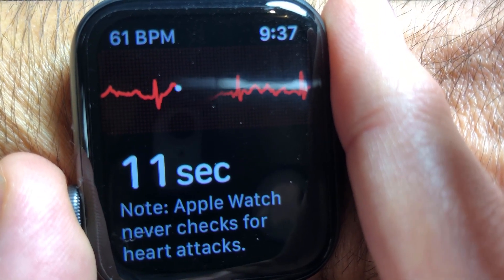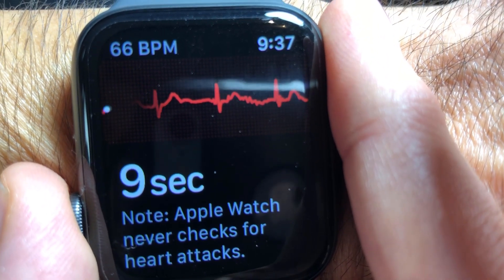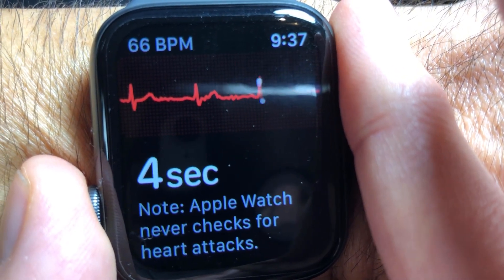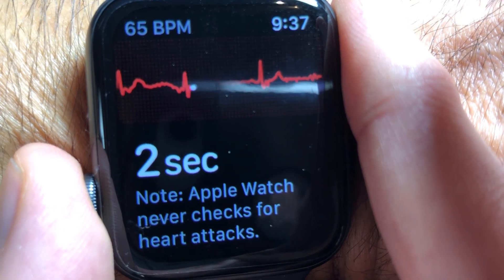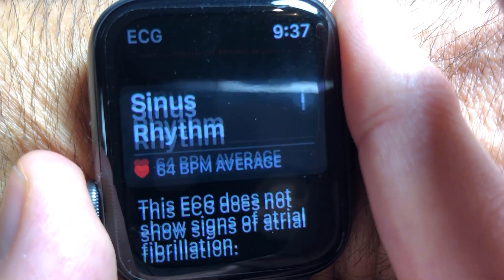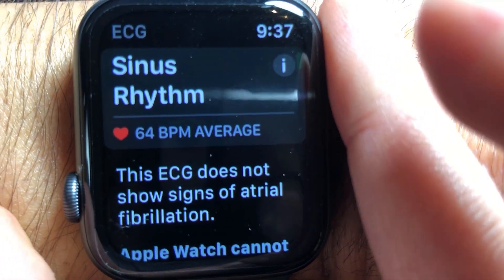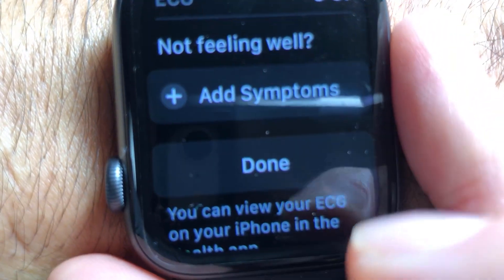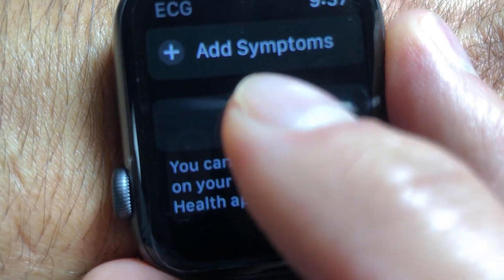As soon as you're done, it's going to tell you whether you have normal sinus rhythm or not. You can see I'm almost done here — I'll be done in two seconds and it'll tell me if I'm normal or not. You can see: normal sinus rhythm detected. You can scroll up and it asks you for any symptoms, and you can click done.